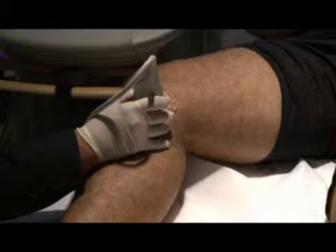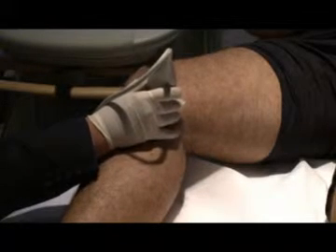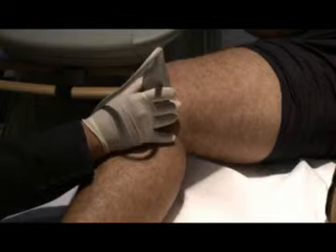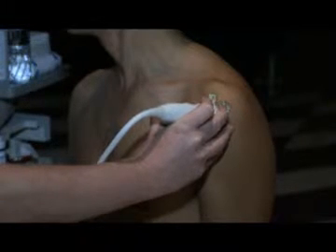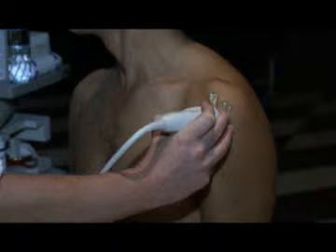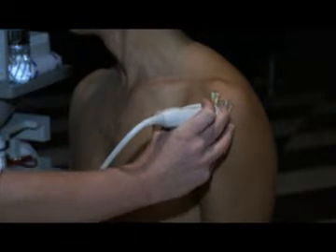On the long axis of the meniscus, all you have to do now is go from femur to tibia, and in between the two, you get to see the meniscus, anterior horn, body, and parts of the posterior horn. And in the middle there, in this groove lies the biceps tendon. And you can see it's dark on this image. If I lower my probe a little bit, you can see it becomes bright. And it's really quite subtle movements that change the anisotropy.